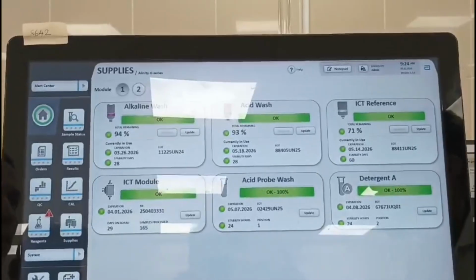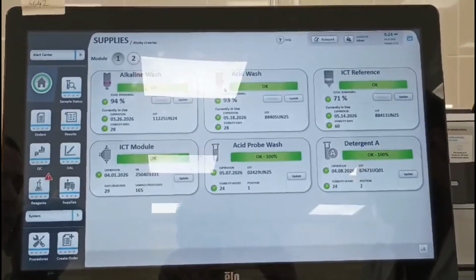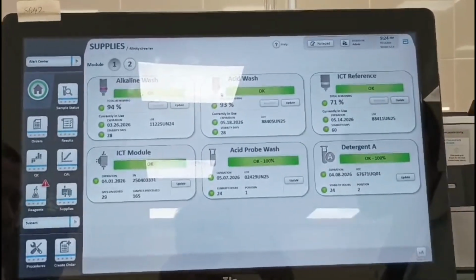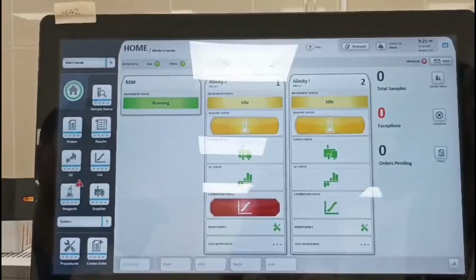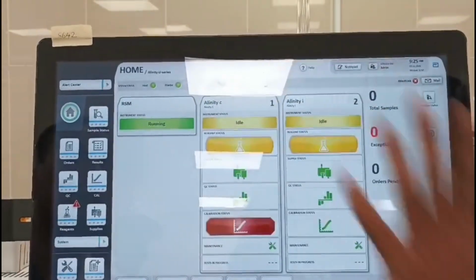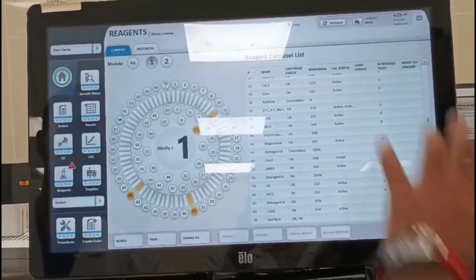You can make it this procedure. Old one throw, take new one, then it should be scanned. Otherwise, it's not showing stability. It's now 24 hours stability. Color also now all green. It's now reagent status. Press. Yeah, this one reagent string.